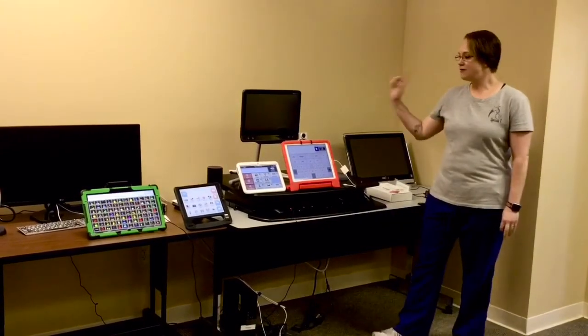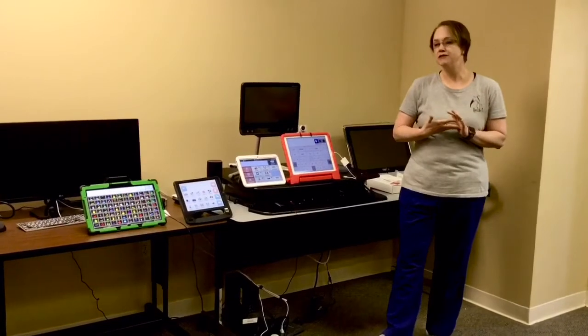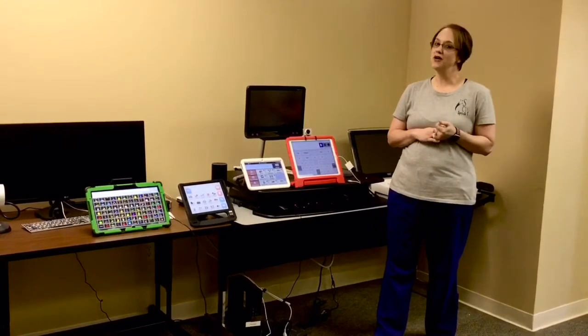Today we're going to talk about some high-tech AAC devices and some different modes of accessibility and different ways to use them to communicate. So I hope you enjoy it.